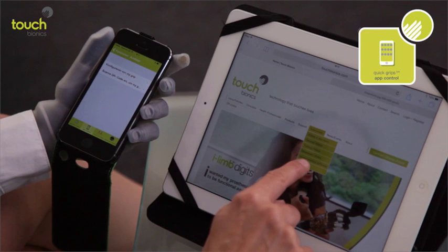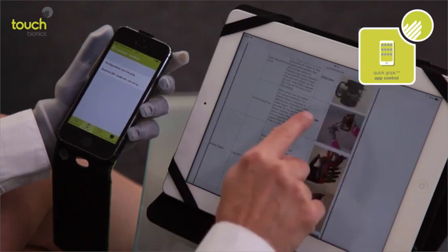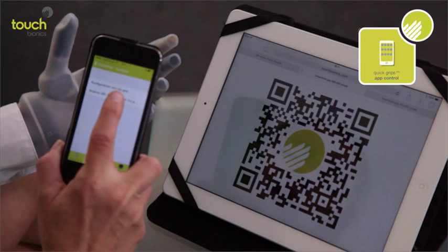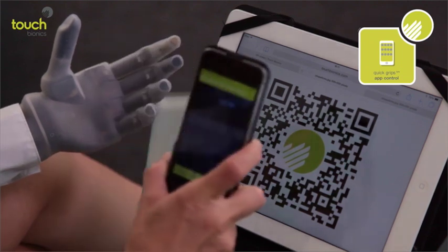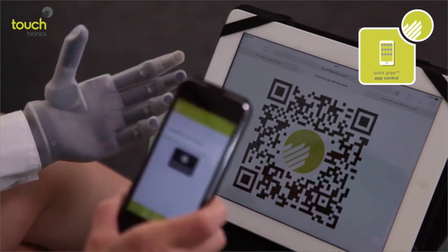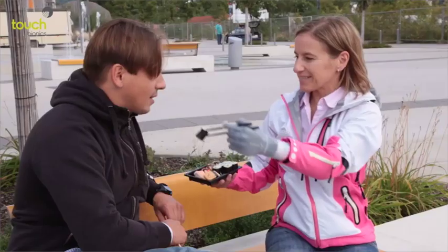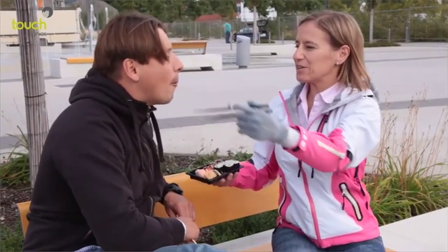So what she's going to do here is find the grip that she wants. In this case, it's chopsticks. She's connected to her hand with her mobile app, and she's going to scan that QR code so that she has access to the chopsticks. Bing. And that's it. So we cut to the next feed, and she's feeding a random stranger some sushi.